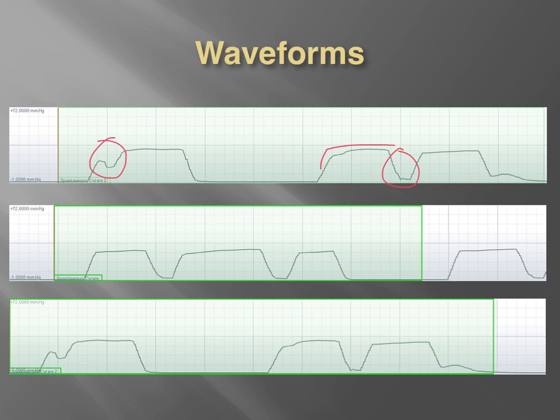However, what's happening here, especially in this one area here, we call that a Curare cleft. And what that typically means is that for our purposes, this patient is sedated but may not be sedated enough, and their body is trying to overcome the ventilator. So what this patient most likely needed was increased sedation in order to reduce the stress on the body.